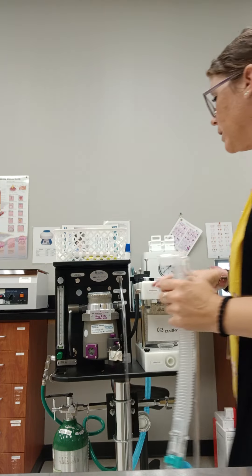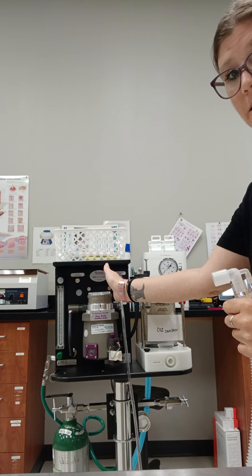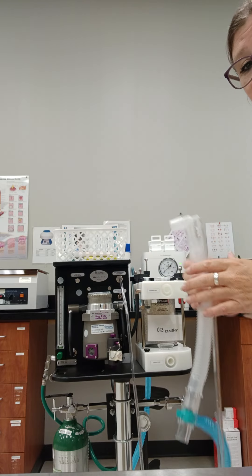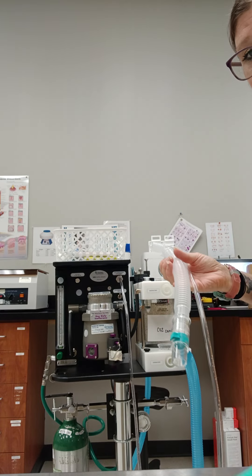At this point, we are bypassing the CO2 canister entirely. We're just sticking on this side of the machine, because with the non-rebreather, the patient's not going to be rebreathing any of that CO2-free air.